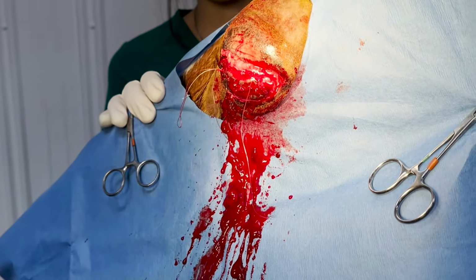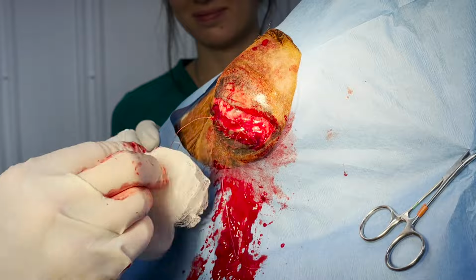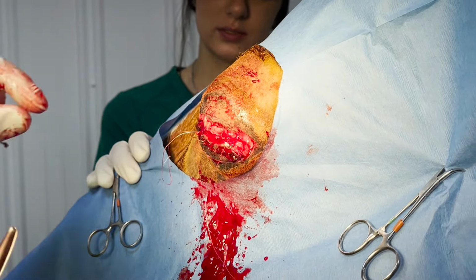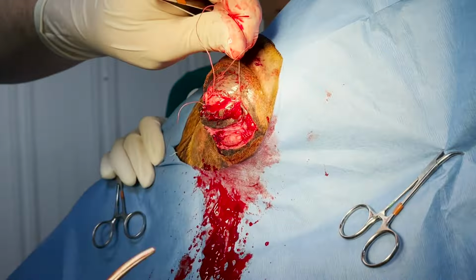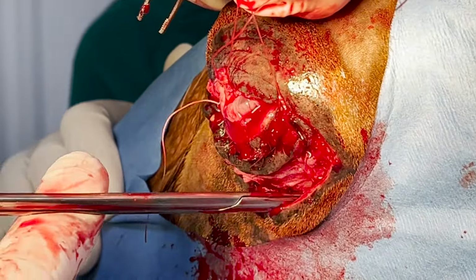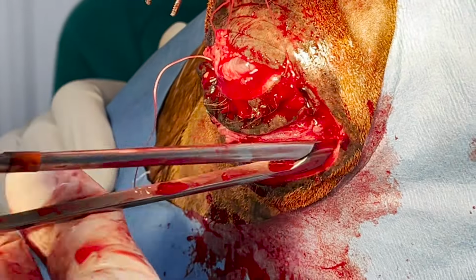I put so much block in there, it's pushing everything out. But I'd rather deal with that than her feel any of this. Poor thing, she's had enough pain. So I can use my handles here, that way I can get underneath there and get back to where we need to get to actually cut.